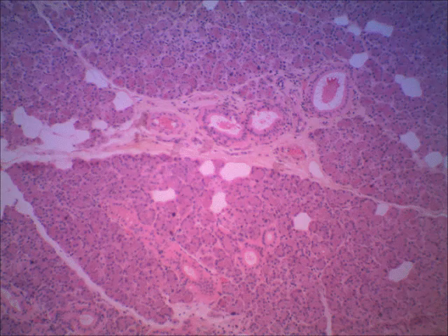But for your test, if we move to another slide, let's look at this again. For your test, you can tell that this is a salivary gland just for this section, because you see the secretory clusters as well as some distinct ducts. Do you see any ducts in this slide? Do you see one there? There's a duct.